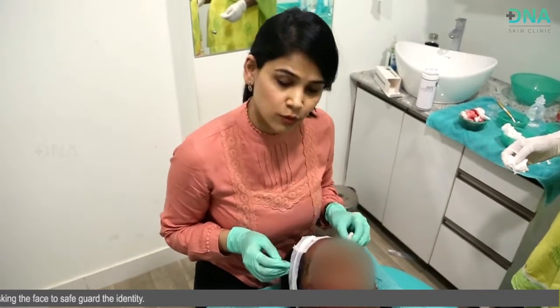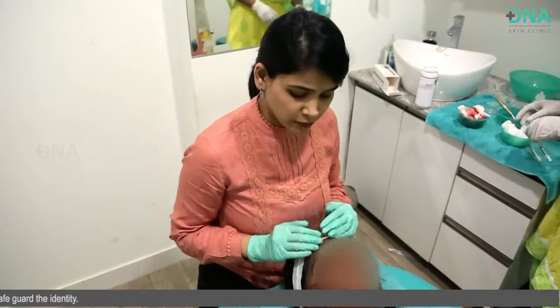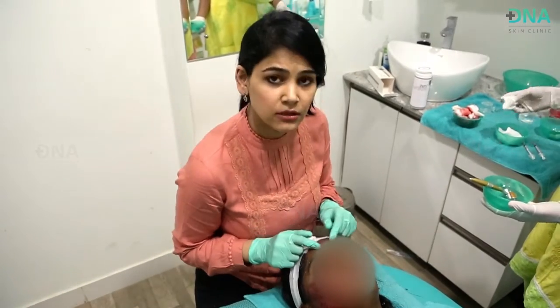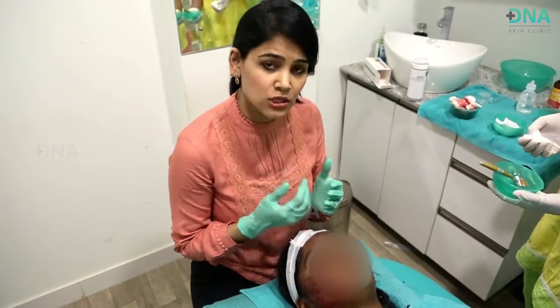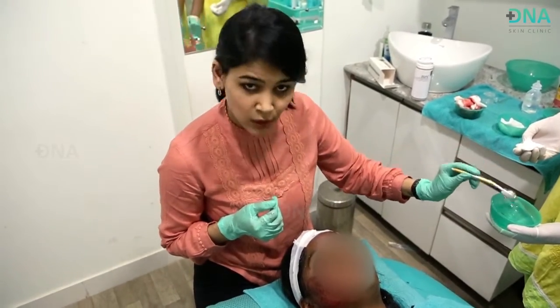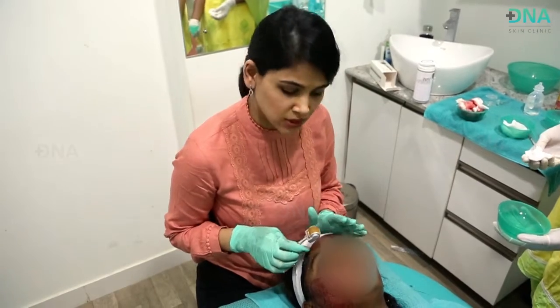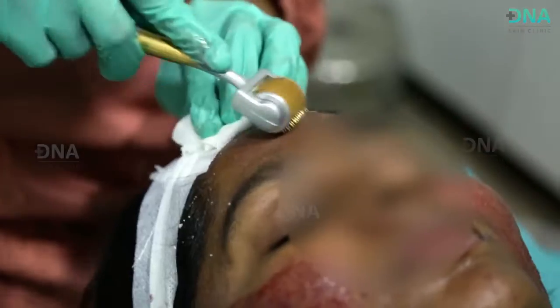So now let's move on to the forehead. The thickness of the skin is different on the forehead compared to the cheeks. So if you want, you can go for a derma roller with lesser depth needles when you're treating the forehead. But for me, I keep the consumable cost for the patient in mind. So I'd like to go ahead with the same derma roller, but I wouldn't go as deep as I went on the cheeks. I'd go a little superficial on the forehead and the temple areas.